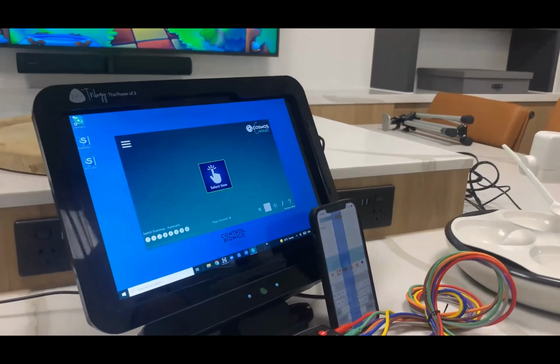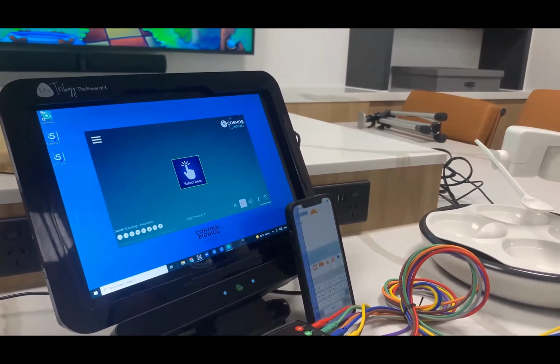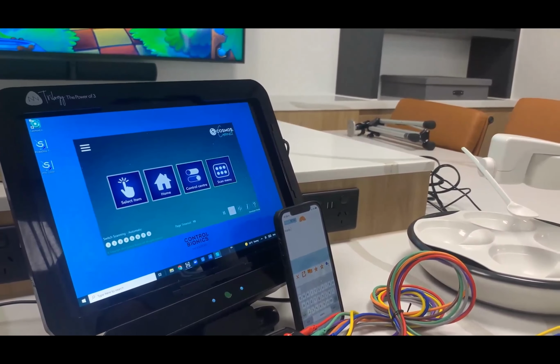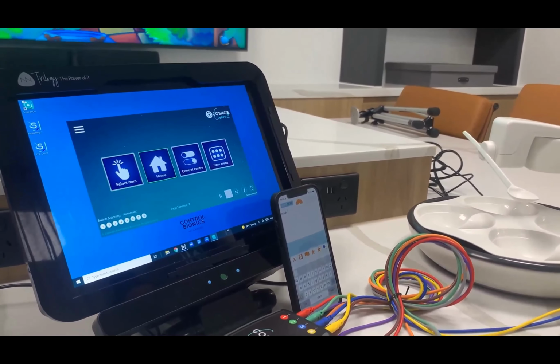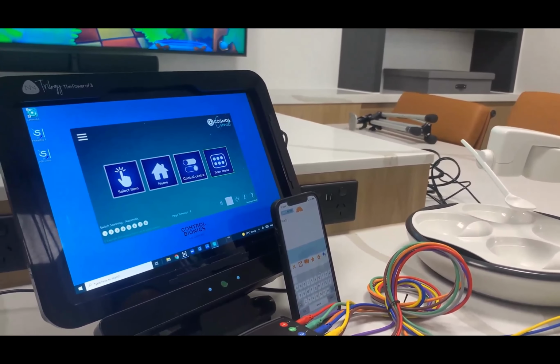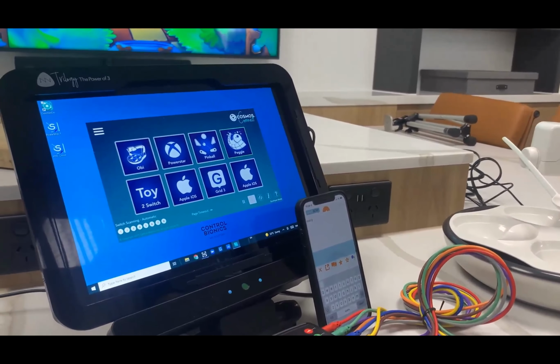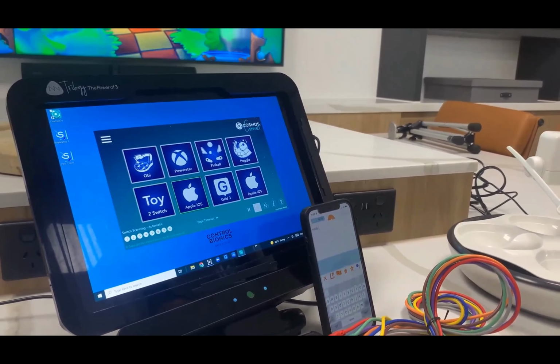And you can see on the NeuroNode Trilogy, it's being controlled through that. It's scanning through the options of what your functions are. So you can see there, like to go home or go into your control settings, control center, all of those types of things. So it scans through that. He makes his movement to then control the external device. So is it doing automatic switch scanning? Just scanning, and then he activates it when it gets to the icon he wants to activate? That's correct. There's no eye gaze with that piece of it at the moment.